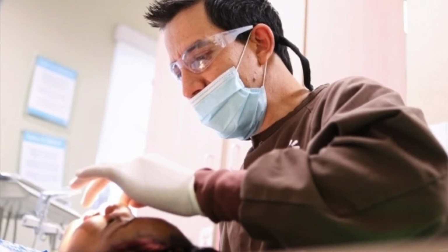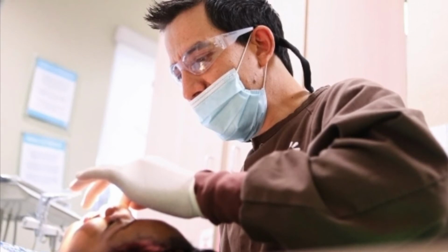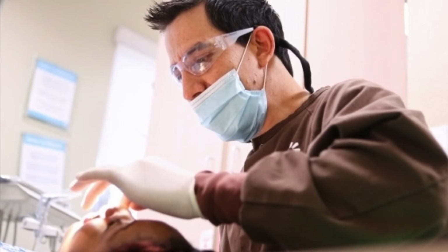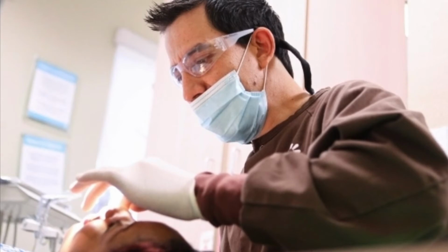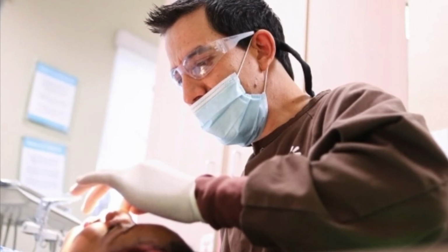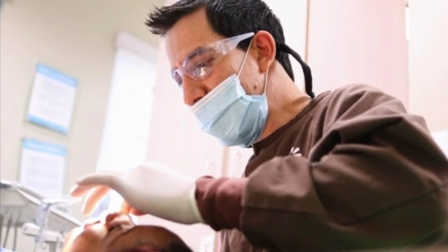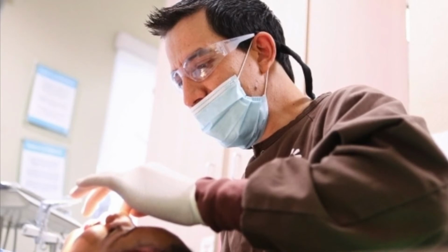A procedure of working length determination. Now I will determine the working length. First, examine the preoperative radiograph and estimate the length of the tooth. Whether it's a long tooth or a short tooth, you have to estimate it.